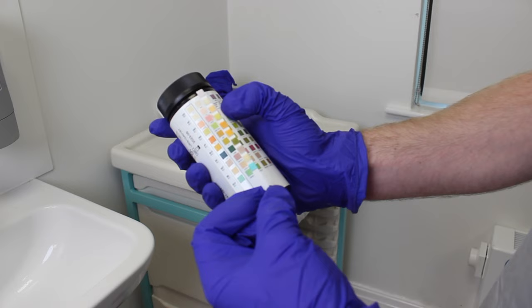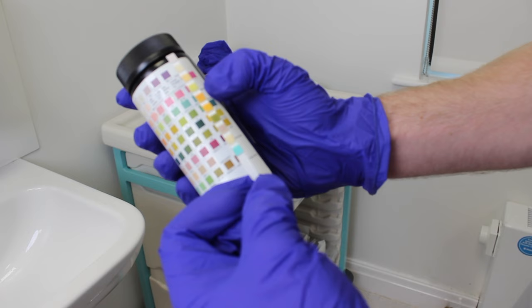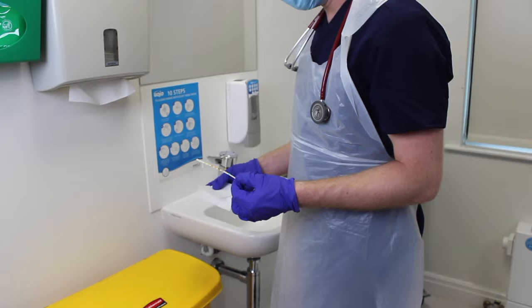Hold the stick at an angle and wait the required time interval before reading the strip against the color chart. Once you've interpreted all of the tests, discard the sample strip into the clinical waste bin along with your PPE.